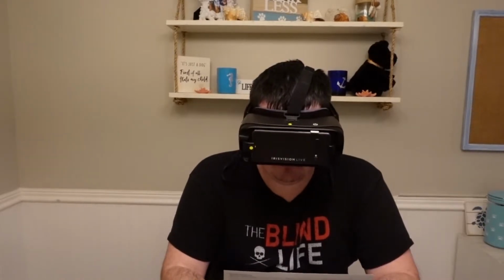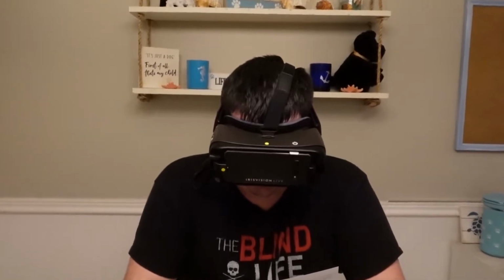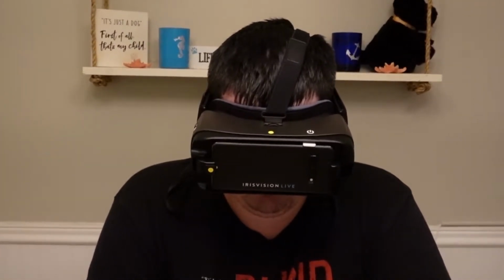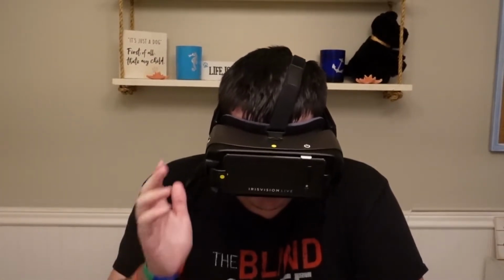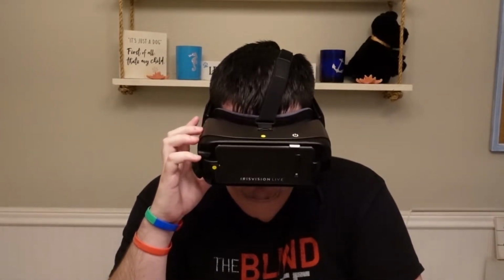So, I'm gonna finish up the video. And right now, I'm gonna tell you, I can't see anything with this. Reader inverted, even at max, it's just not really doing anything for me.